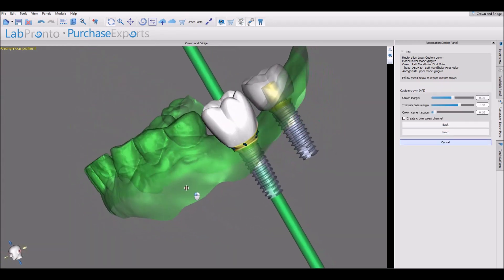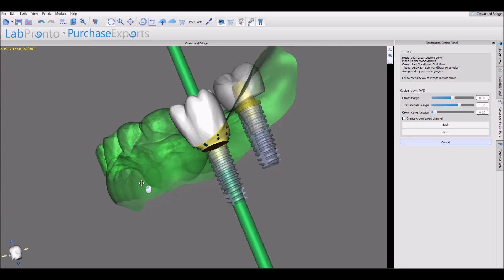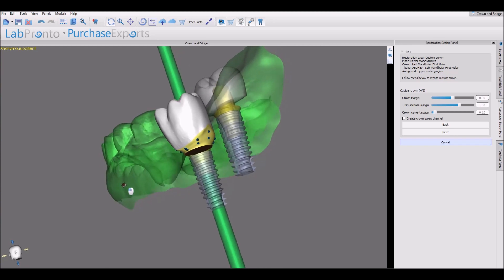Now we're going to design the connection of the crown to the tie base. We have options for modifying the crown margin, changing the titanium base margin, and changing the spacer between the titanium base and the crown. We also have an option of creating a screw channel just by clicking the checkbox. Let's click Next.